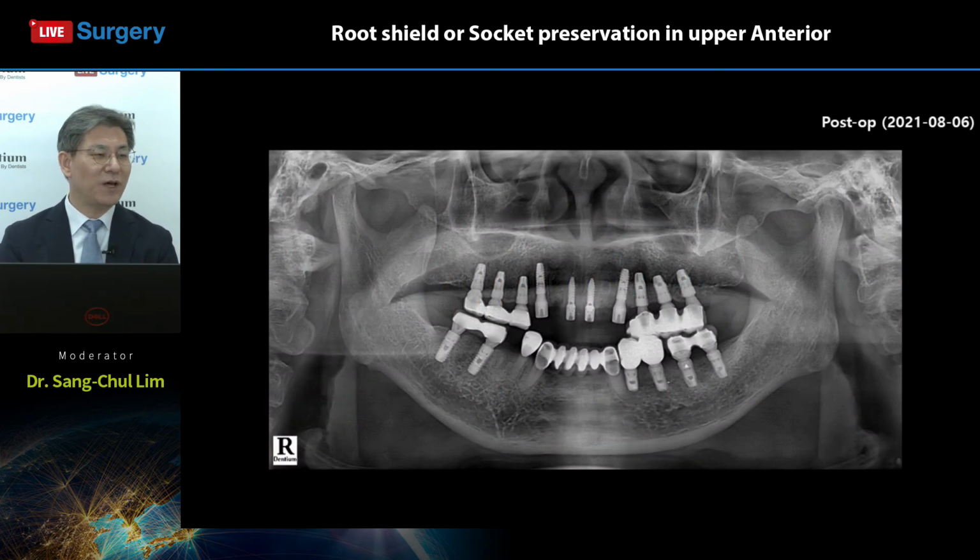Okay, this one is the post-op panoramic view. As you can see, very nice, well done implant installation. In the canine area, a 4.0, 11 millimeter bone level implant installed, and the central incisor, this one is tissue level, 3.5 diameter, 9 millimeter. A very nice, well done installation. The direction and the depth of the implant fixtures are very nice. So the platform is good.